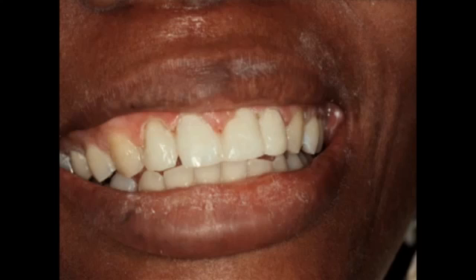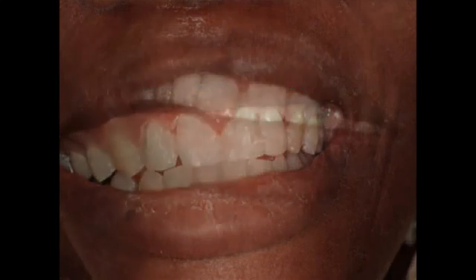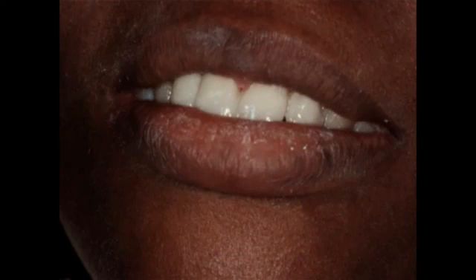Remember her request. I don't know how many of you get this request. I want to look perfect when I leave today. So we're able to reproduce all the subtle enamel irregularities of this patient without the diastema in 15 minutes. I challenge anybody in the world to take as much time as they want and try to do this type of work. So we removed the flash.